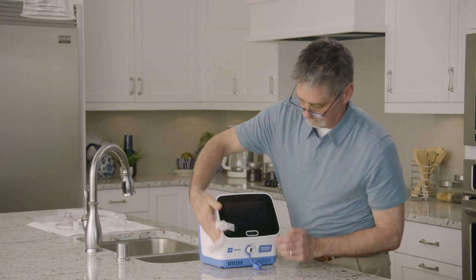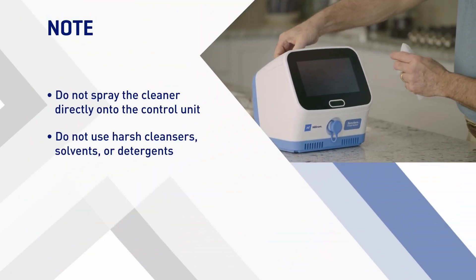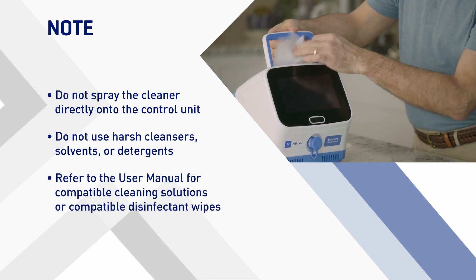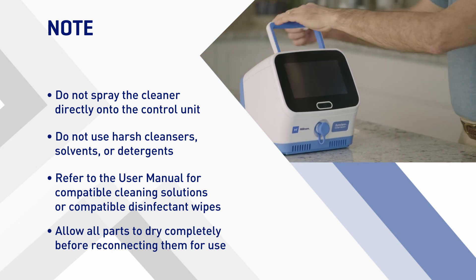Place the therapy port cap over the therapy port. Do not spray the cleaner directly onto the control unit. Do not use harsh cleansers, solvents, or detergents. Refer to the user manual for compatible cleaning solutions or compatible disinfectant wipes. Allow all parts to dry completely before reconnecting them for use.